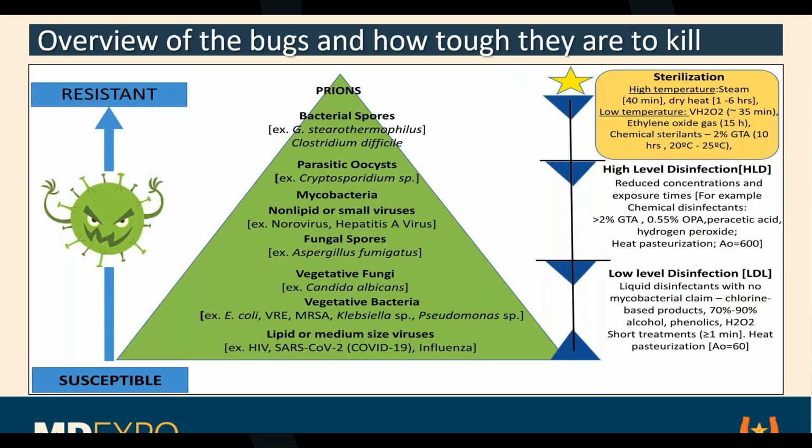And so OEMs who manufacture the automated testing or cleaning devices, high-level disinfecting devices, have to determine, based on the indications for use, what the likelihood is of one of these bugs showing up anywhere on that device when it's used according to the OEM's intended use. And then it goes into which ones are really bad and which ones can be killed off fairly easily.